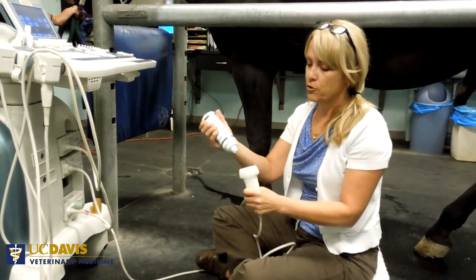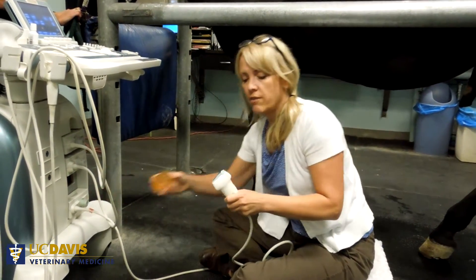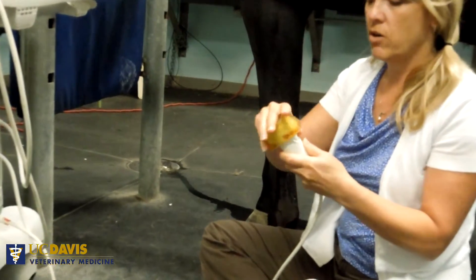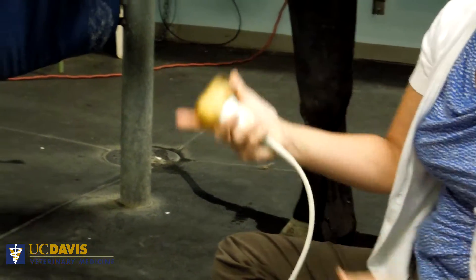The first thing is if you're using a standoff, you want to make sure that you put some gel between the standoff and the transducer, but not too much because you don't want the gel to come oozing out and make it real slippery to hold on to those two structures or the transducer.